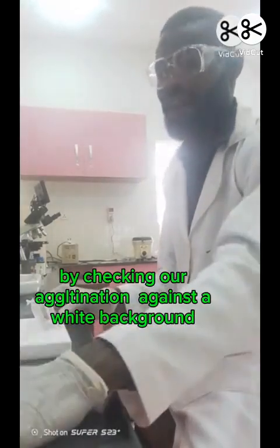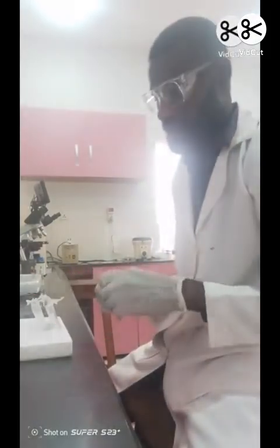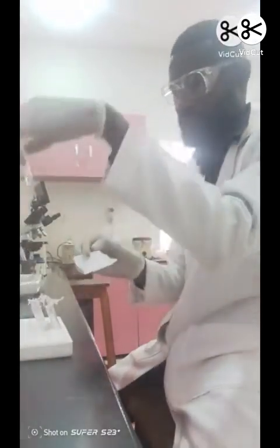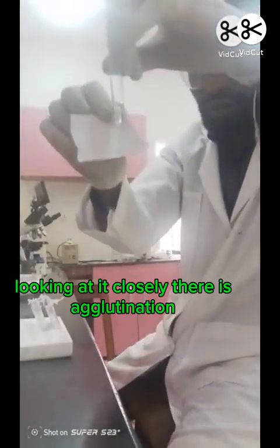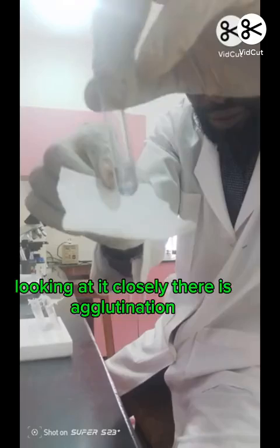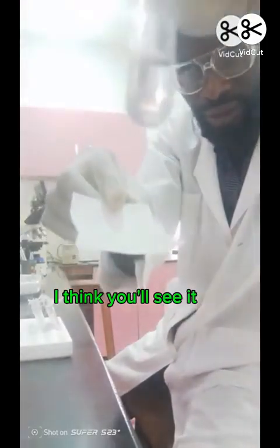So today we are reading the test result by checking our agglutination against a white background. Now we're going to start with paratyphi. Looking at it closely, there is agglutination. I think you see it.